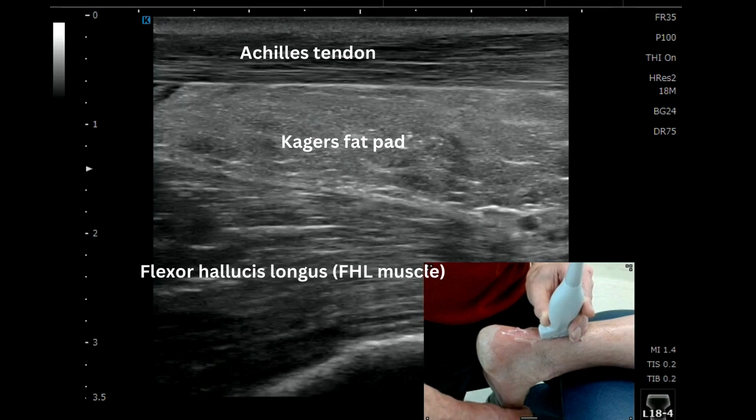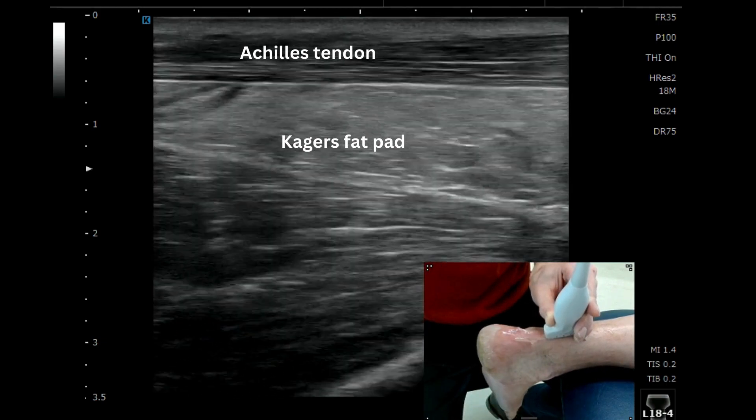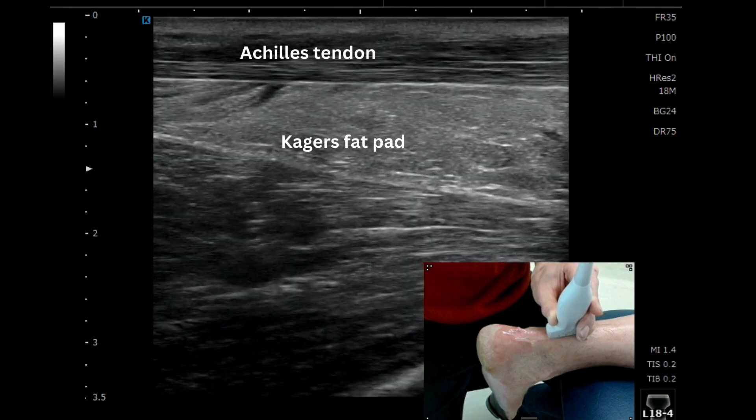You can see that very clearly here — the CAGAS fat pad superficial to it and the most proximal aspect of the CAGAS fat pad.